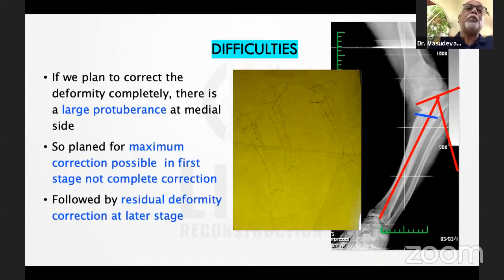Now we know how to put a Schanz screw obliquely. You can get a better hold, and you can use multiple olive wires. So you can do the osteotomy even near the corner, below the tibial tuberosity, in a different direction. That will give a more cosmetic and perfect, nice correction. Yes. Agree. Okay. And somebody was asking about the MCL.